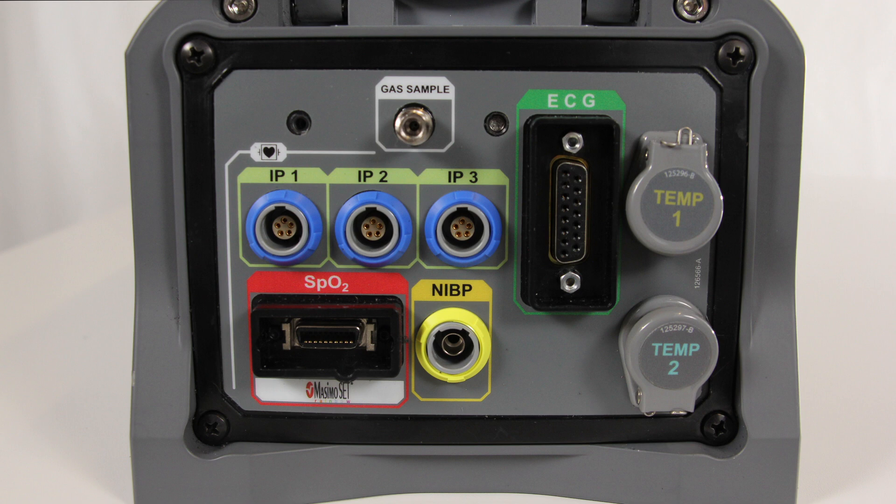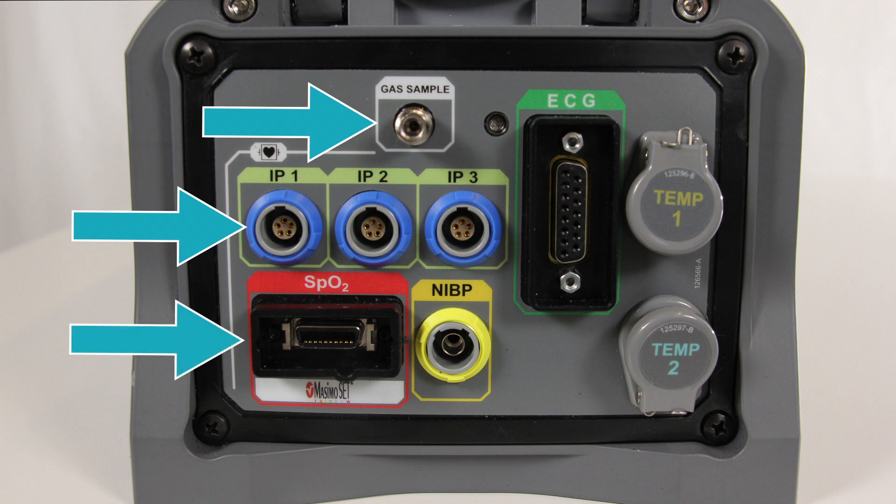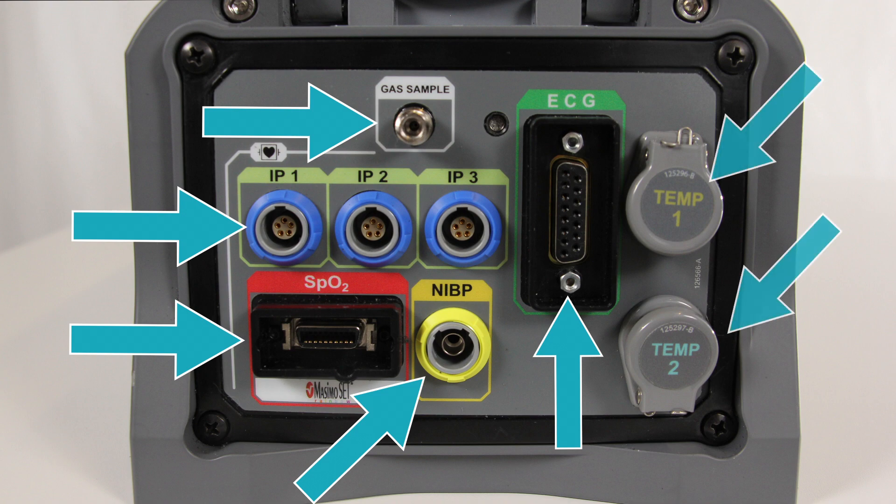The MOVES SLC allows you to monitor several parameters. On the Patient Connection Panel, the following ports are available: the Gas Sample Port, Invasive Blood Pressure, SpO2, Non-Invasive Blood Pressure, ECG, and Patient Temperatures.